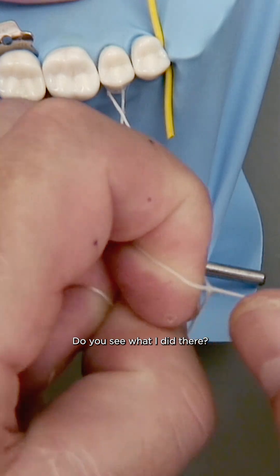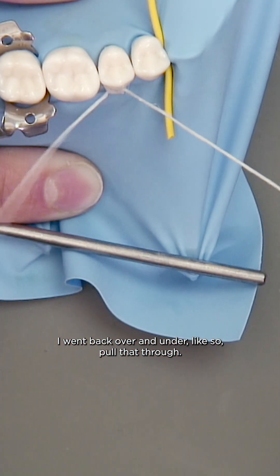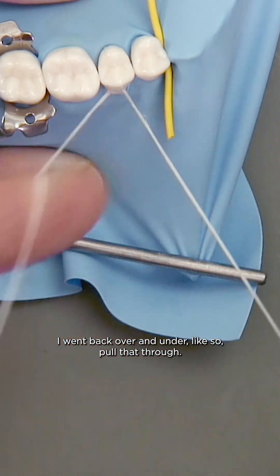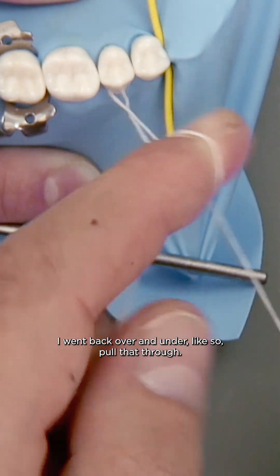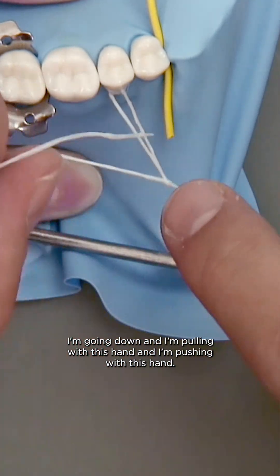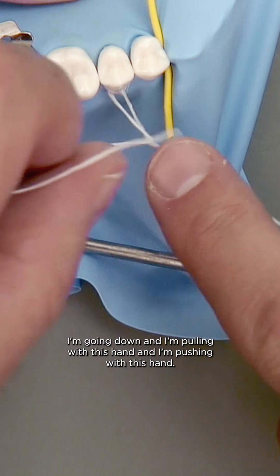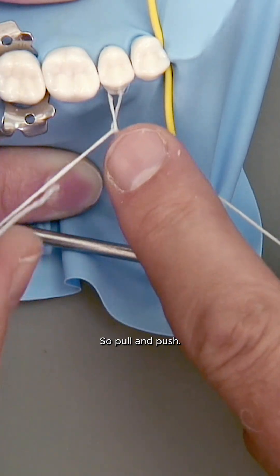Do you see what I did there? I went back over and under like so, pull that through, and then I'm going down and I'm pulling with this hand and I'm pushing with this hand — so pull, push.